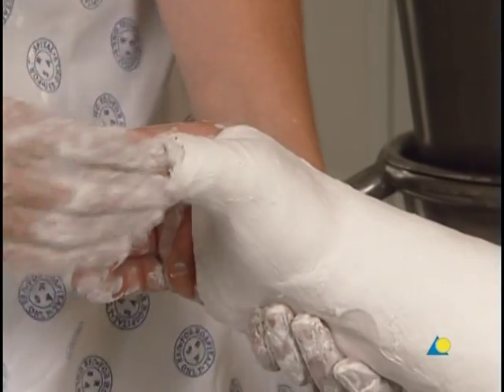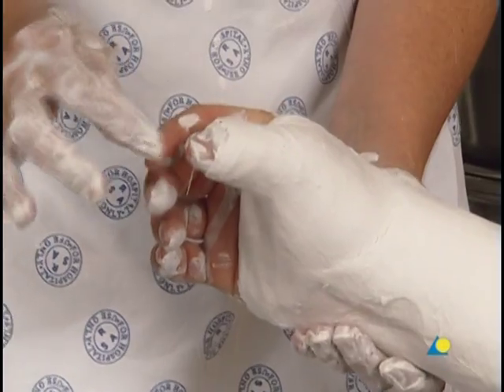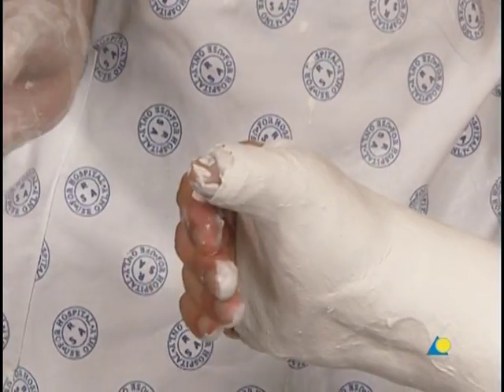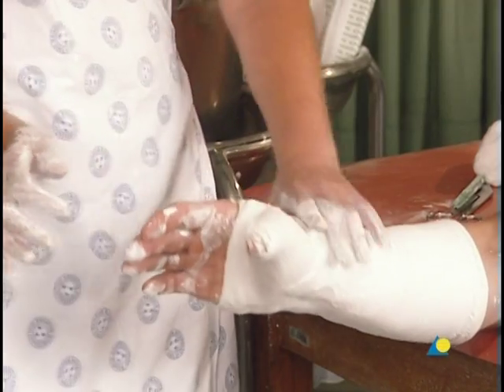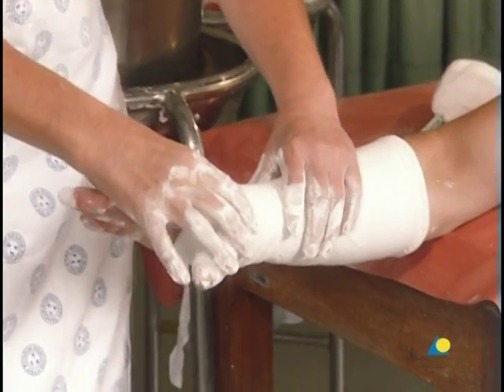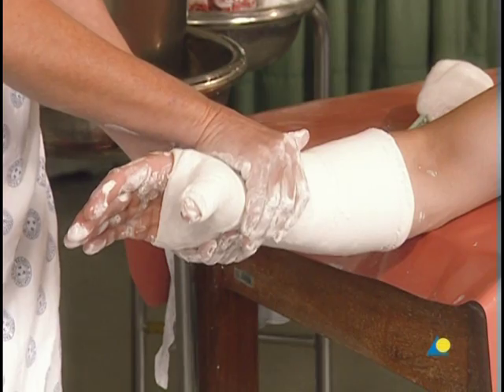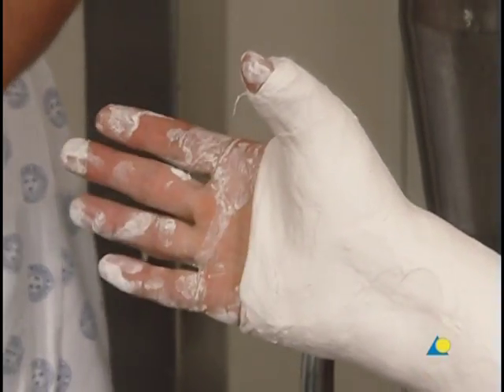The correct positioning of the thumb is checked by asking the patient to hold a pencil or similar object. The application of the thumb spica is now complete.